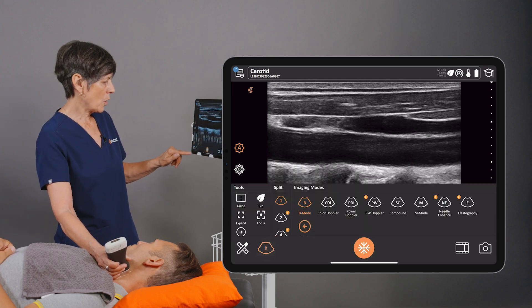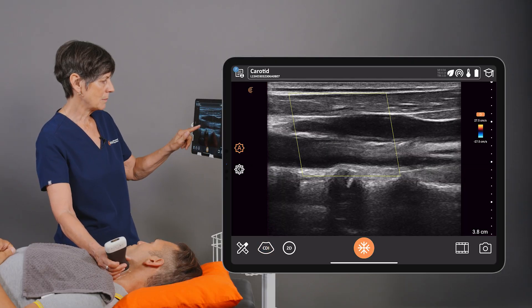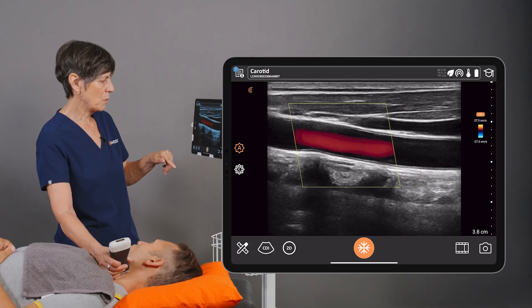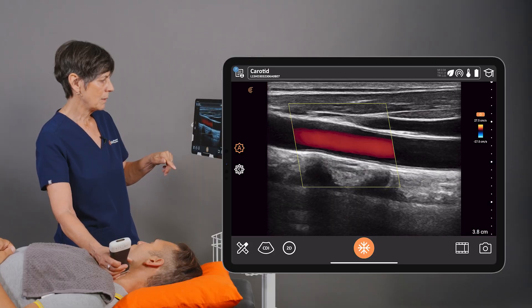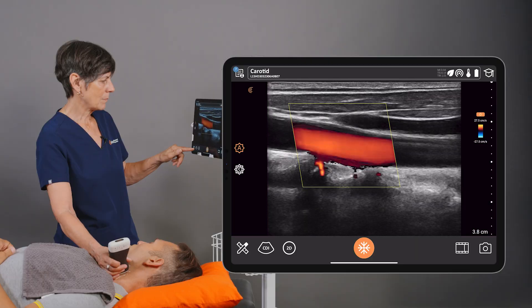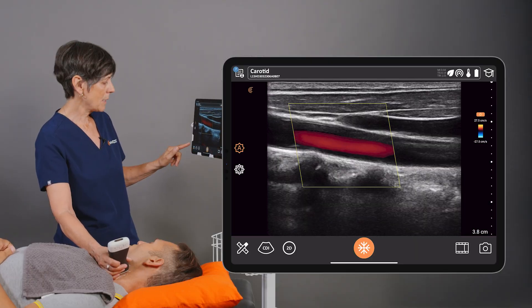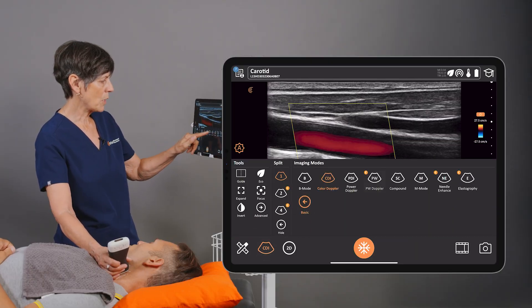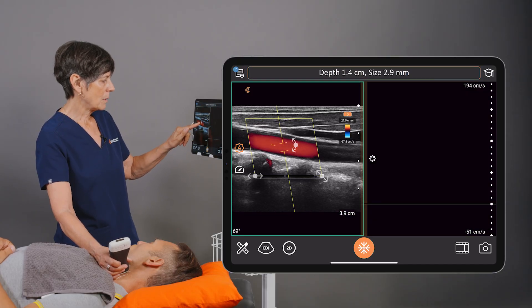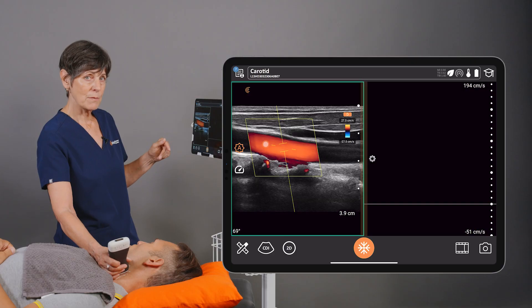Now I'm going to turn on my color Doppler just to check for any abnormalities in the flow. When I have an idea of where I want to measure the velocity, I can go into the pulse wave Doppler option and center the sample volume in the center of the vessel.